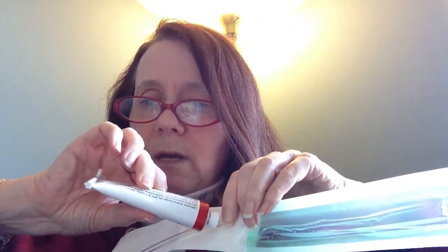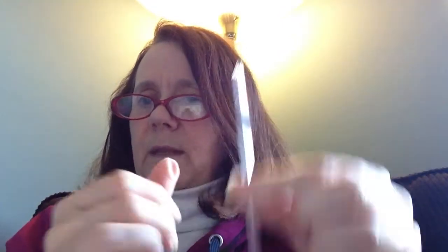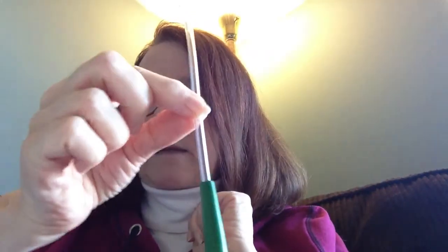And then what I do is I put a blob of lidocaine gel on the tip, and then sort of roll it around to make sure that a good portion of the tip is covered in lidocaine gel. I want to make sure that there's a good amount on there so that it assures painless and easy insertion into my urethra. So I prepare that, and as soon as that's ready, then I catheterize myself and drain my bladder. So this is the end that the urine is coming out of, into either, like I said, a collection container or the toilet.